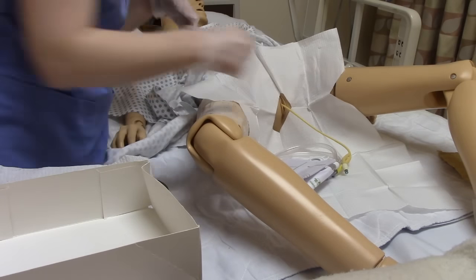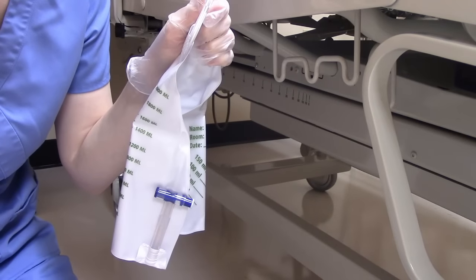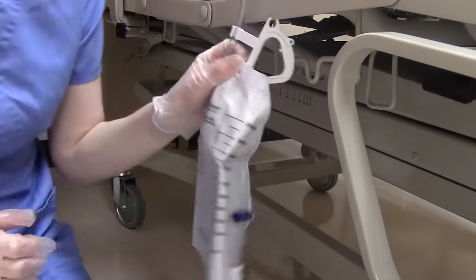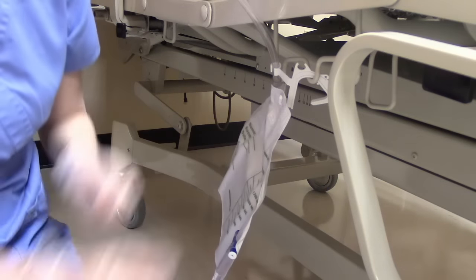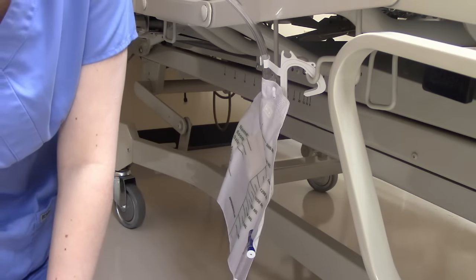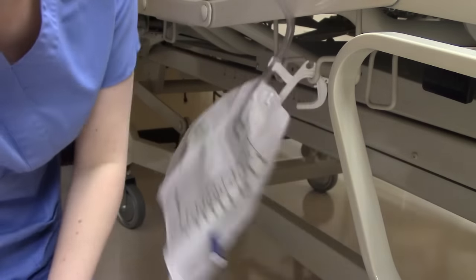Now we can clean up our mess. We're going to put the tubing with a stat lock on the patient's leg — never under the leg because that can cause a pressure sore. We need to attach it to an immobile part of the bed, not a side rail or movable part. And we are below the level of the patient's hips — if the bag were up higher, that's going to cause backflow of urine, which causes retention, pain, and possibly infection.